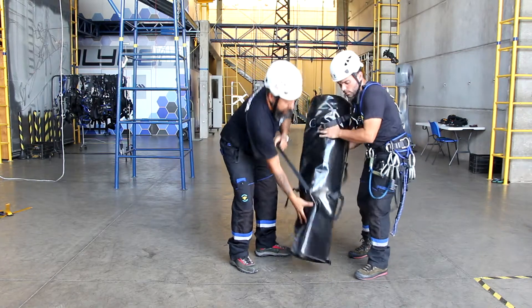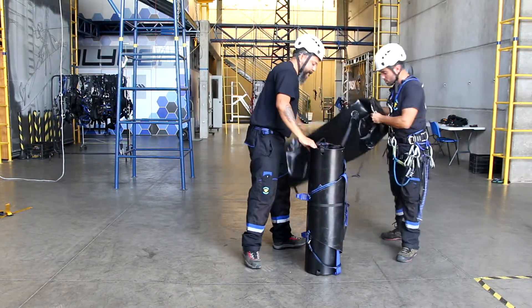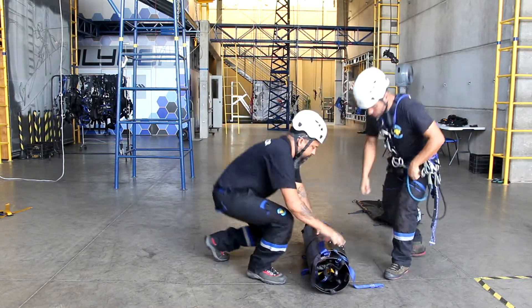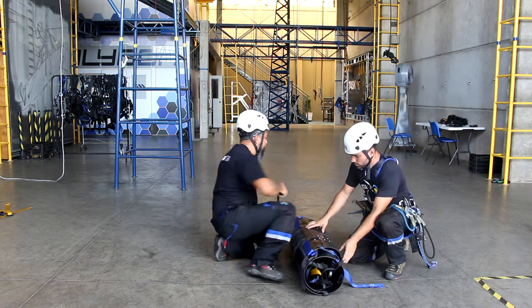Unrolling the stretcher. First, remove the stretcher from its backpack. It's important to put the stretcher in an upright position. Start to unroll the stretcher.